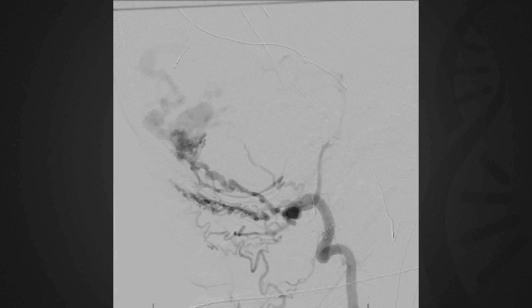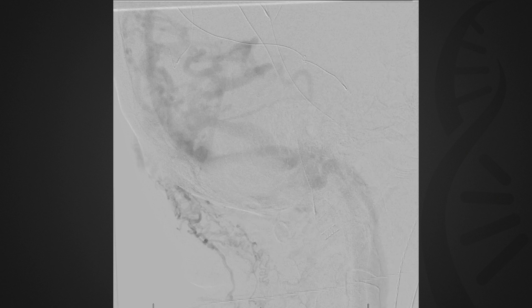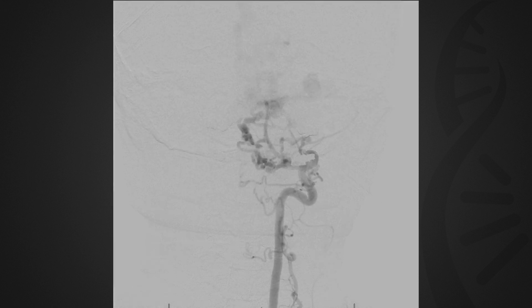Additionally, the artery of Bernasconi and Cassinari off the left internal carotid artery provided further supply to the complex fistula. The fistula's pouch appeared to run parallel to the transverse sinus on the left. There did not appear to be any evidence of outflow restriction involving the left sigmoid sinus and internal jugular vein.